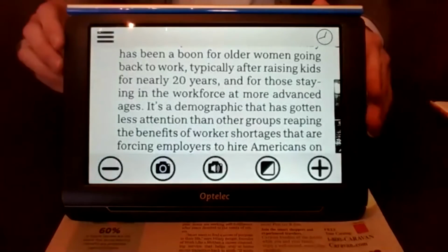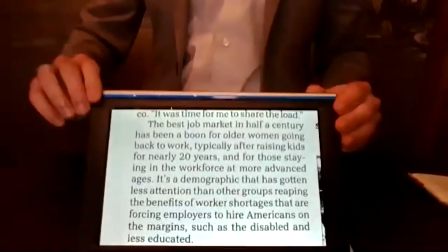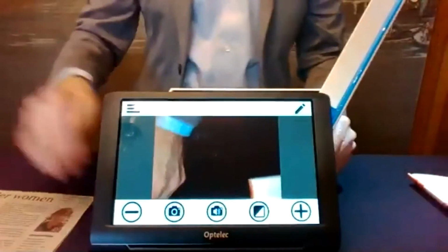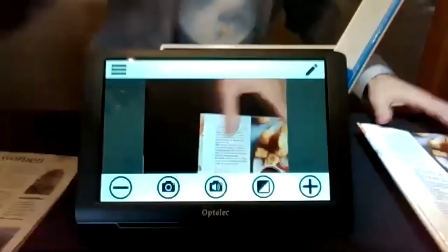So I do want to show that arm. I'm going to just flip this up a little bit. So here's that arm we were talking about. And when we pull that out there, you'll notice now that it automatically switches to a different camera. And pull this down here.